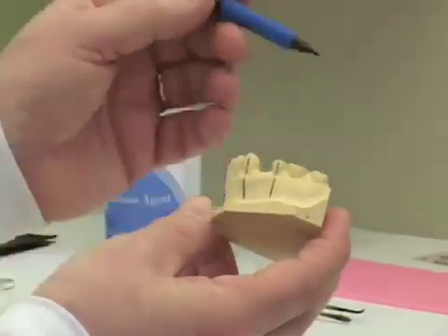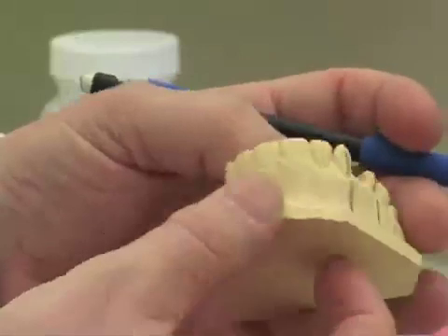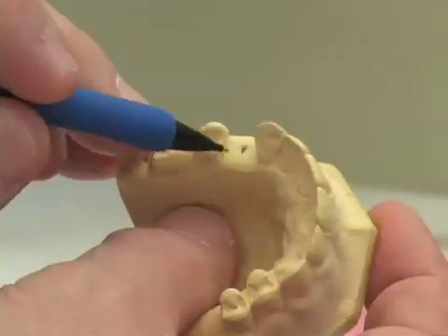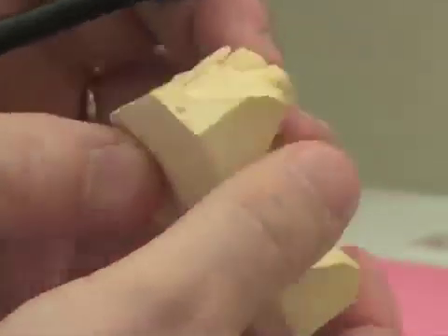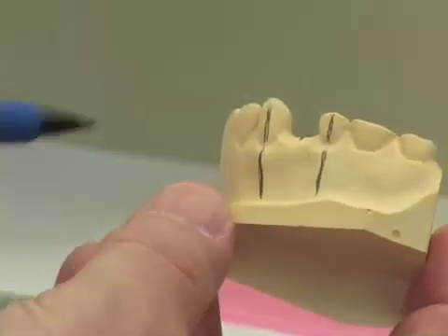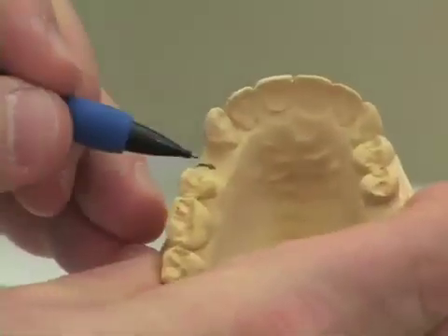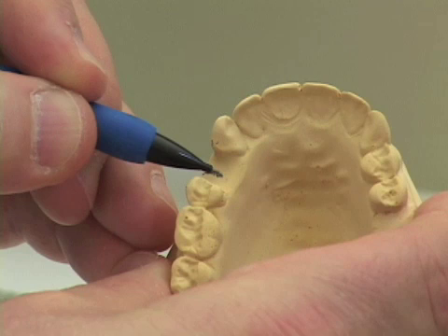The next thing I want to do is make as good an estimation as I can of the exact center of the space. I turn the cast and look down on it from above to find the center of that edentulous space, marking the center area between the two teeth. Looking again from the buccal or labial aspect, I split the difference between the adjacent tooth roots. From the occlusal aspect, I also determine the buccal-lingual position of the implant.